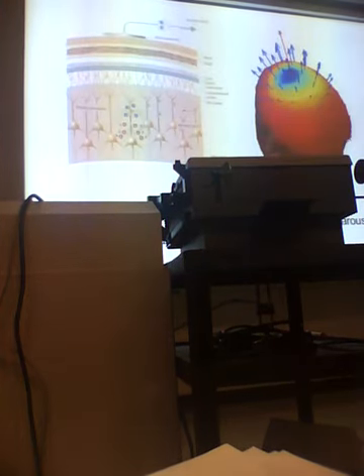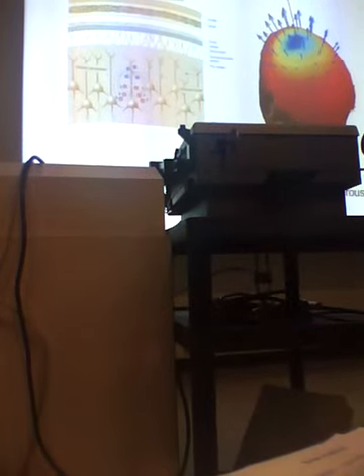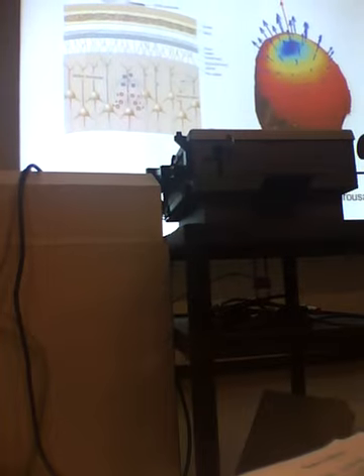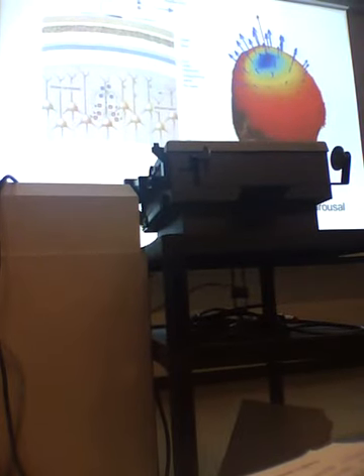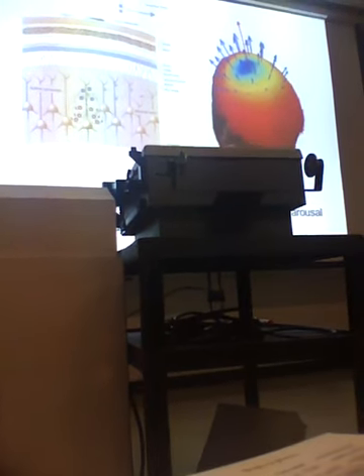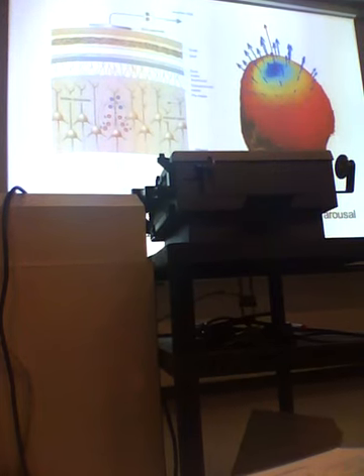Now, the way that EEGs are generated, well, they're generated way down in the neural tissue, underneath the skull. Here's the bone of the skull and the skin, and then there's spaces here, and so on, the dura. So really, the recordings you're getting from the brain are actually a long way from where the actual signals are generated. And that means you get a very low spatial resolution. In other words, you can't really say exactly where these signals are being generated. There are computer methods that you can localize it a bit better, but in general, it's a pretty poor spatial resolution. Nevertheless, the signals are robust, and they have certain patterns to them.